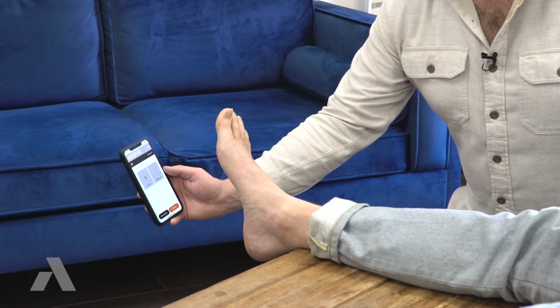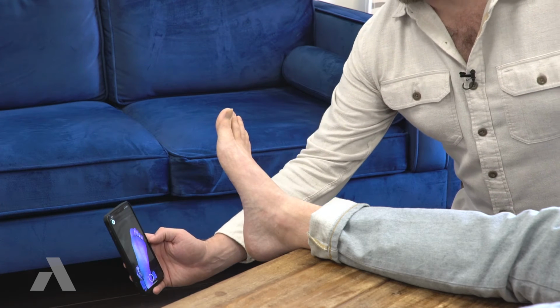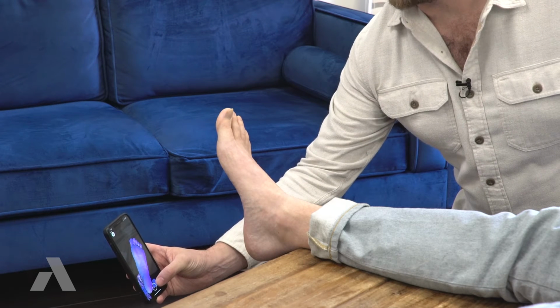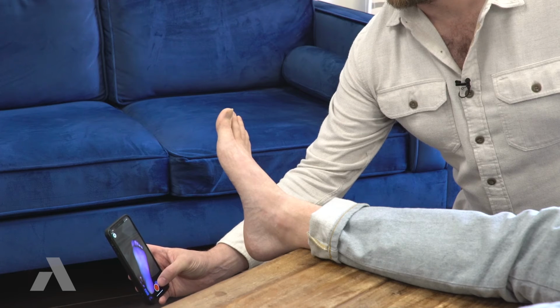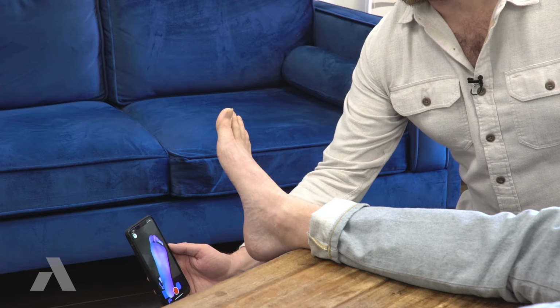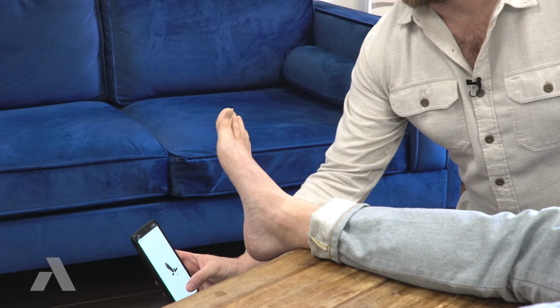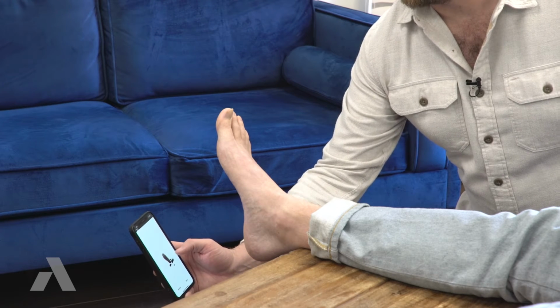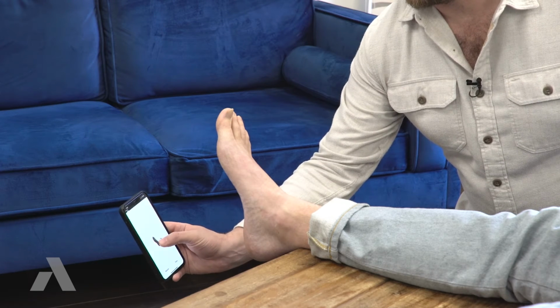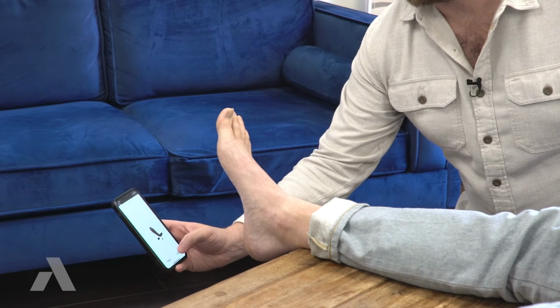Now that we have the left foot scanned, we'll do the exact same for the right. Again, making sure everything's captured in blue and purple, we're going to take what I like to call a selfie of that foot. Again, making sure everything smooths out and getting a good capture of the medial and lateral aspects of the arches. Clicking the Stop button once we have everything we need. And now in our preview, we're able to spin this around and take a look and make sure everything looks good on our end. If so, we could click Save.